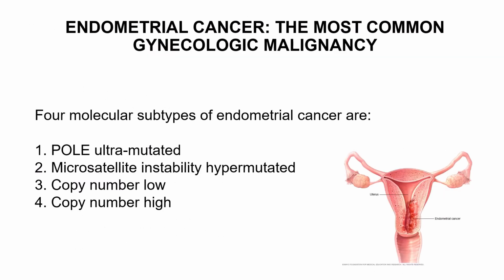Considering endometrial cancer. As you already know, endometrial cancer is indeed the most common gynecological cancer in postmenopausal women. Following the guidelines set forth by The Cancer Genome Atlas, the TCGA, in 2013, we have adopted a molecular prognostic subgrouping approach.